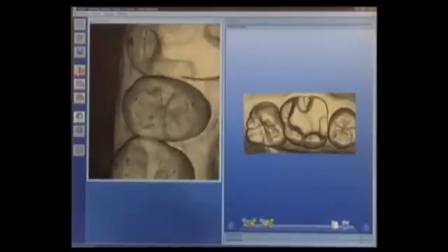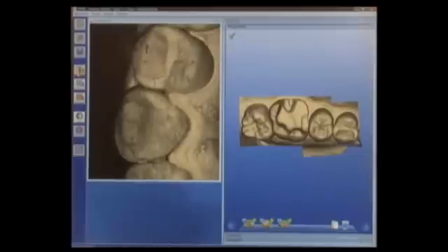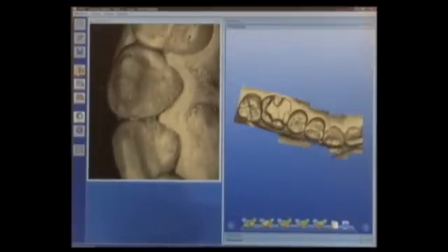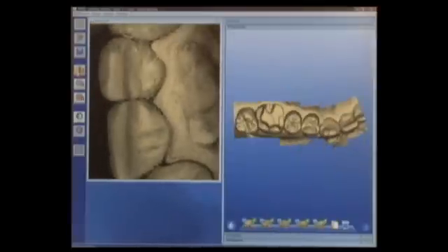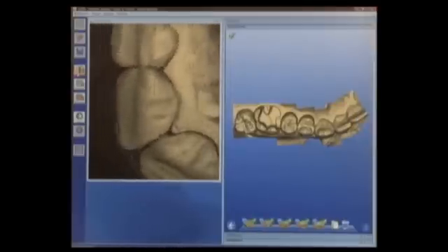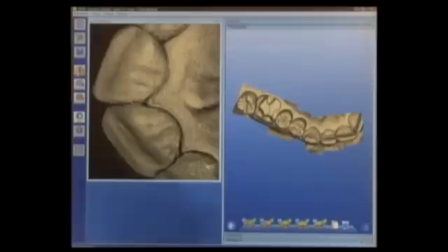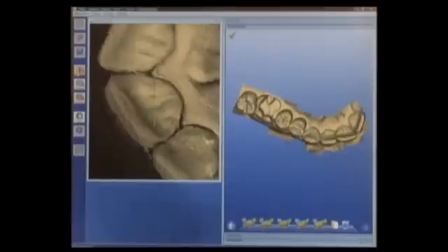Then as I move forward, I'm going to overlap by about 50%, stopping each time and allowing the capturing system to capture an additional image. As I do so, we'll see the model grow on the screen. We'll go all the way past the canine to lateral and central incisors, and again crossing the midline. Notice I'm also capturing a bit of the palatal area with these midline images.